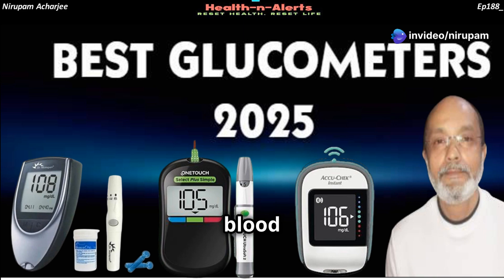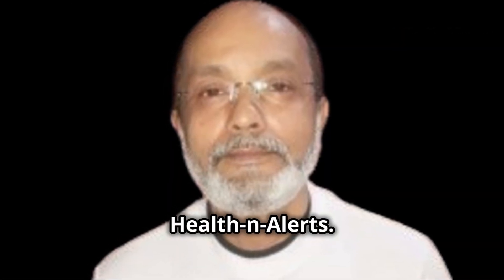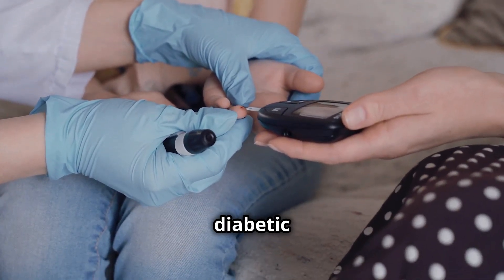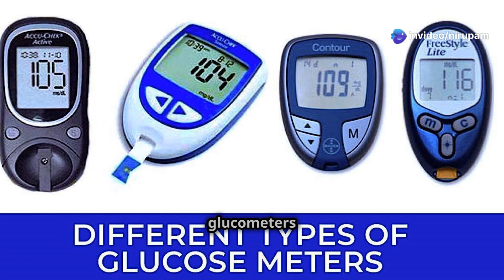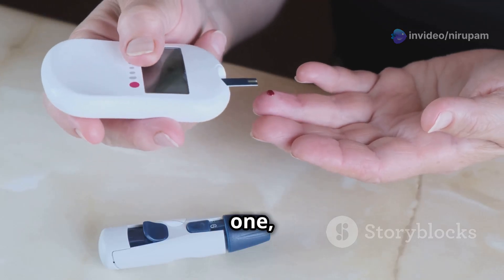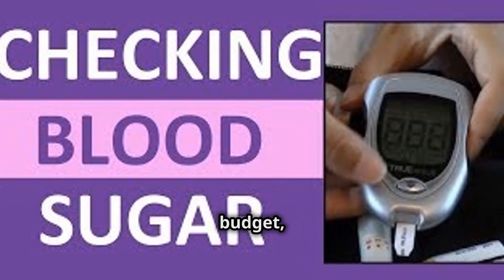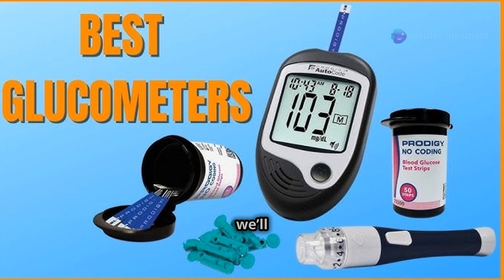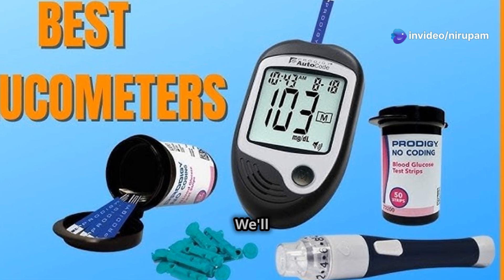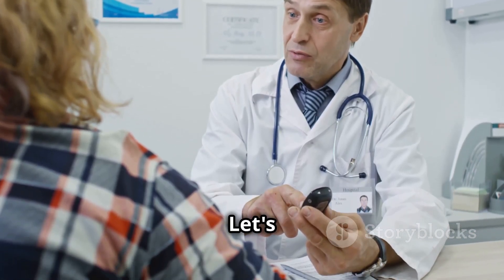Top 3 Glucometers for Easy Blood Sugar Monitoring at Home. Hey everyone, Nirapam here with Channel Health and Alerts. Managing your blood sugar is crucial for overall health, especially if you're diabetic or pre-diabetic. Thankfully, innovative glucometers make it easier than ever. Whether you're keeping tabs on your health or helping a loved one, finding the right glucometer is key — you want something accurate, easy to use, and fits your budget. In this video, we'll dive into the top 3 glucometers, break down their features, pros, and cons, so you can make an informed decision.